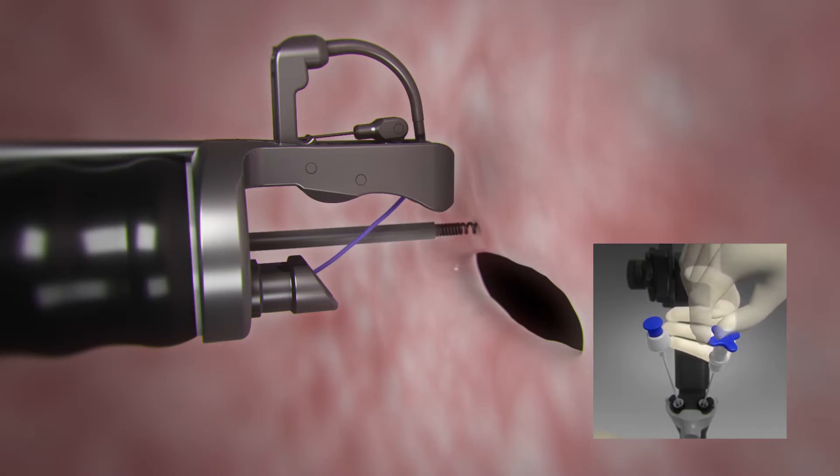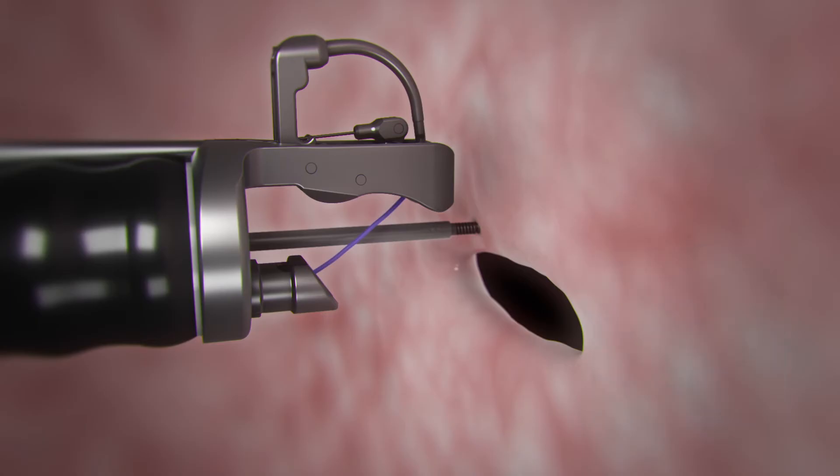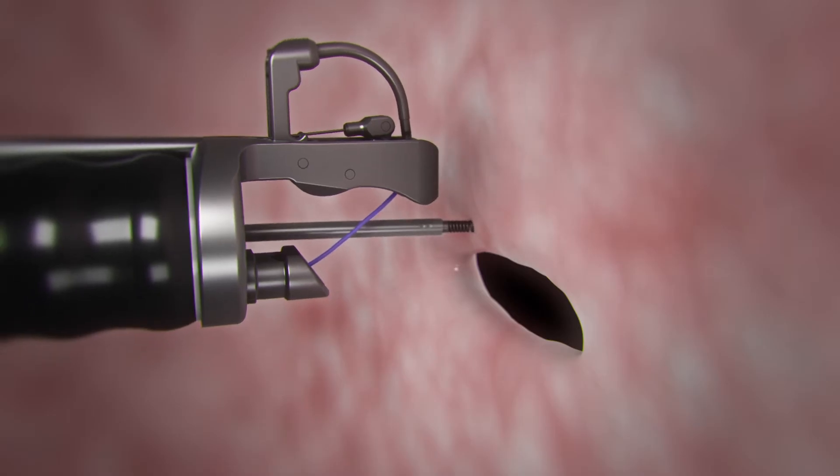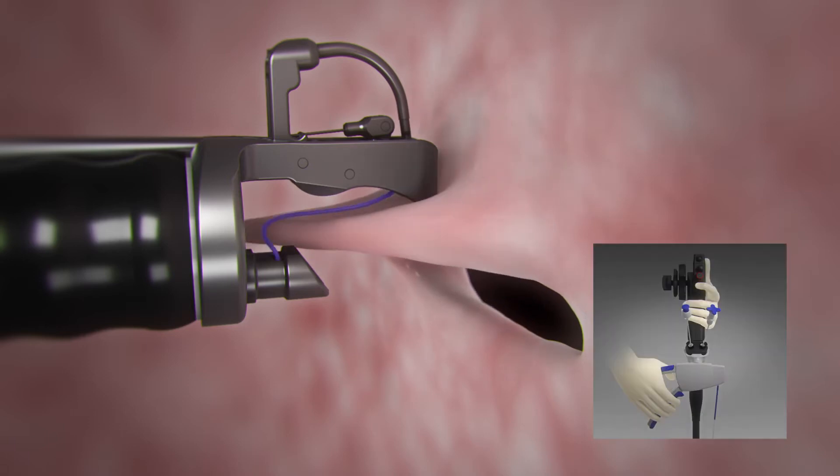Using forward pressure, turn tissue helix knob in the clockwise direction to capture tissue. To ensure a full thickness bite, maneuver scope left so that the helix is right of the needle guard. Pull tissue until it reaches the scope.